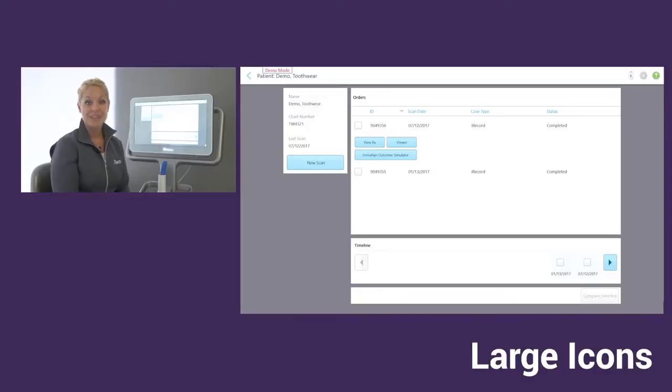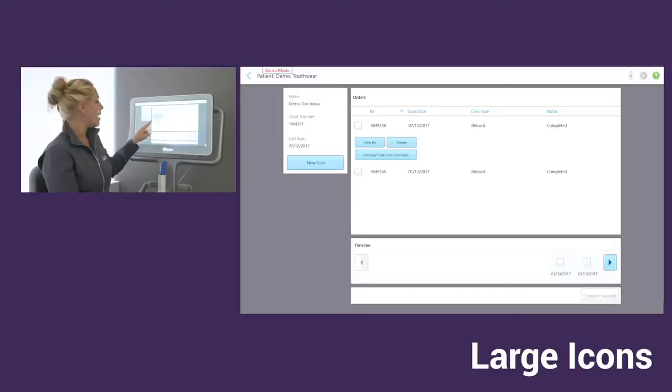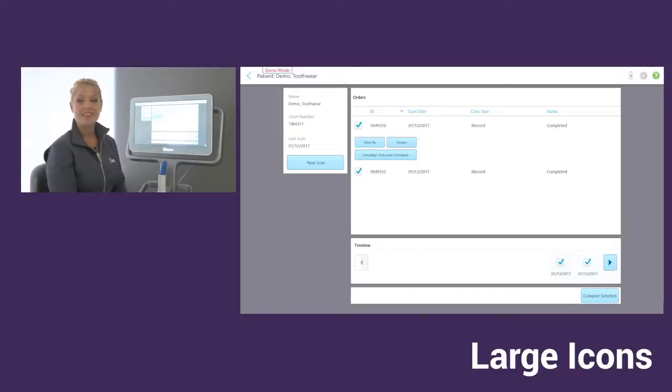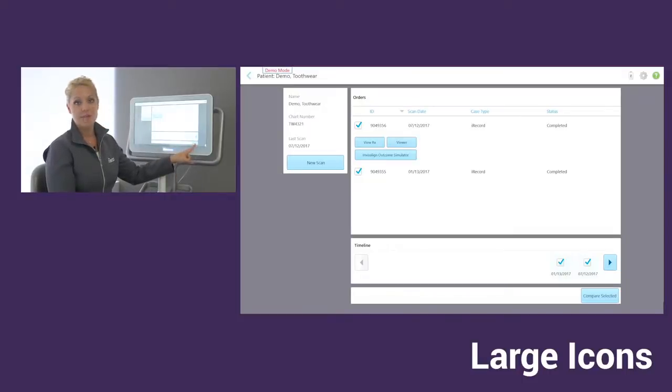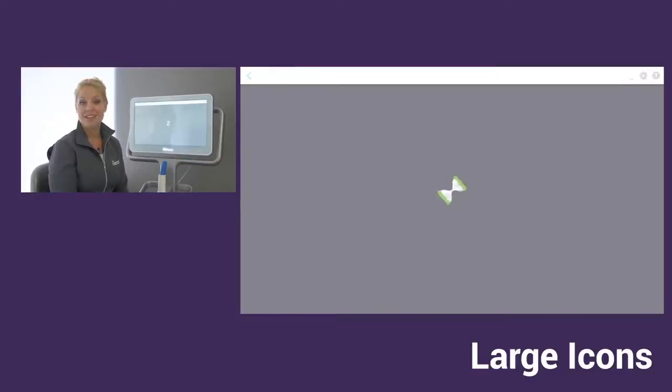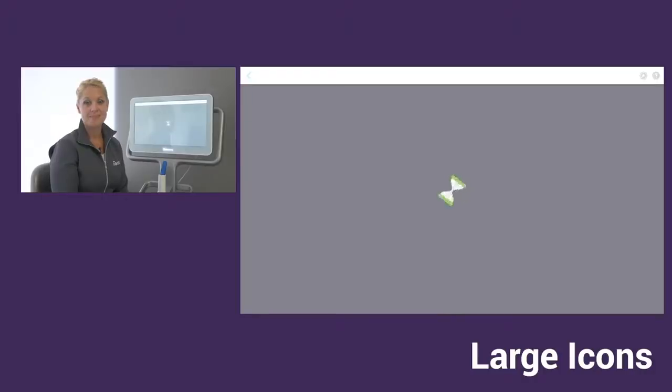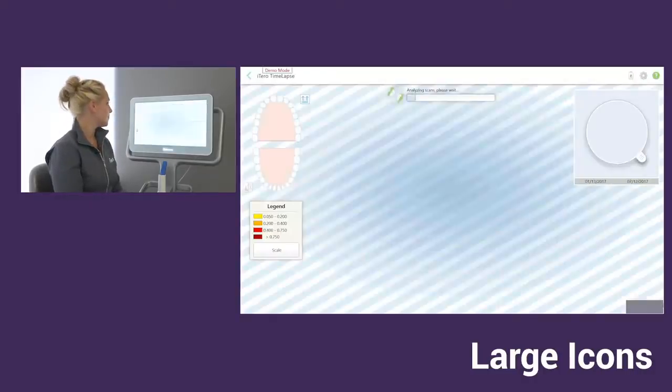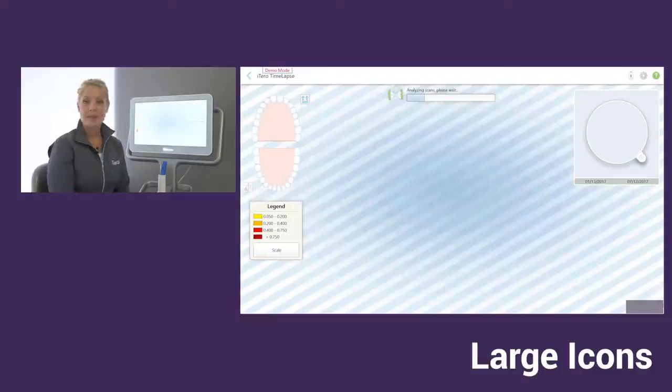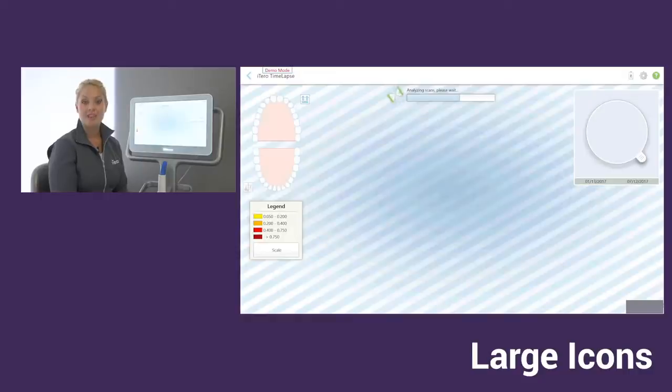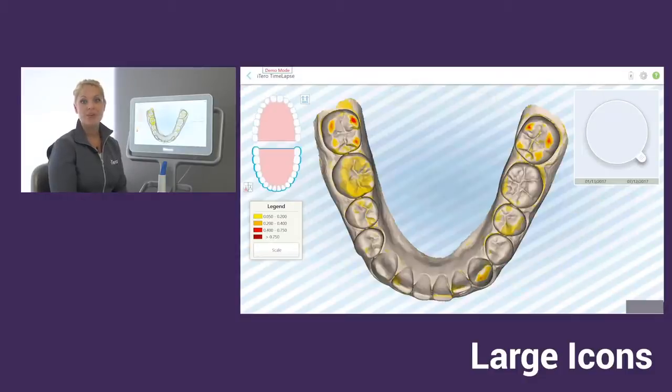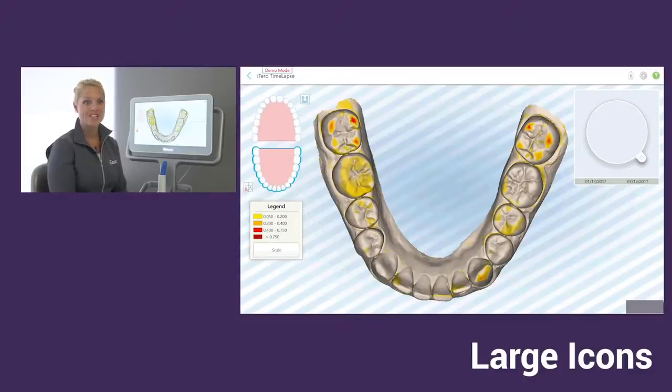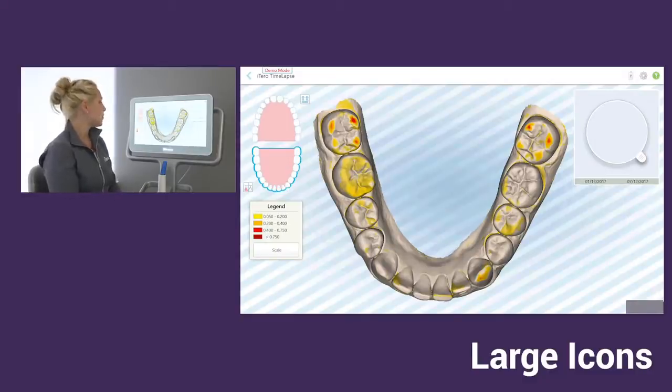Now in our Patients icon, this is the only area where you can run the time lapse software. For time lapse, you'll notice next to each scan that we have, we can check mark the box. When we have check marked any two scans for your patient, this compare selected option opens up. When I tap on the compare selected option, this will run time lapse. Time lapse is nice because it lets you compare any two scans for your patients and the software is going to highlight areas in the anatomy where change has occurred. Wherever we do see change, we're going to see some color coding on the teeth varying from yellow to red, depending on how significant that change is.